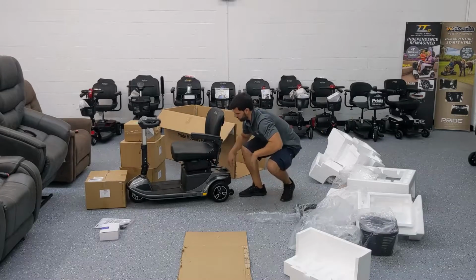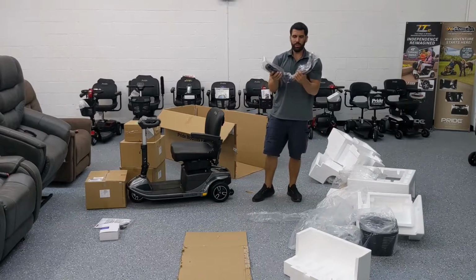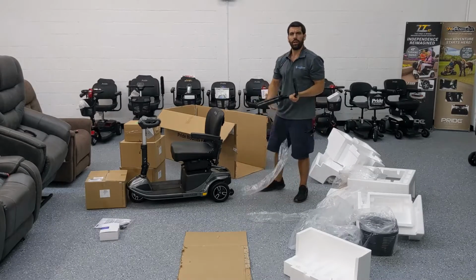Once you've got the pin through, tighten up the knob. I'll quickly do the same on the other side. We'll fast forward through that to not keep you waiting.